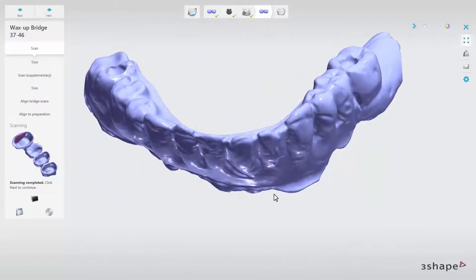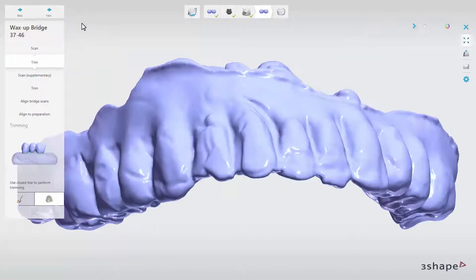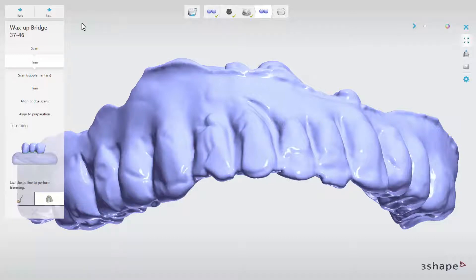When scanning is completed, go to the next sub-step. In here, you can use our trimming tools to trim a little bit of the scan, or you can simply choose Next to go further.